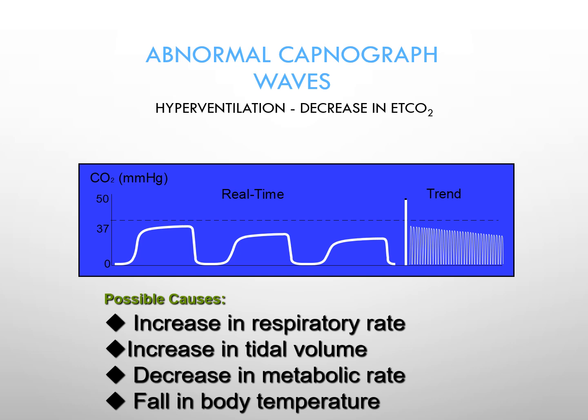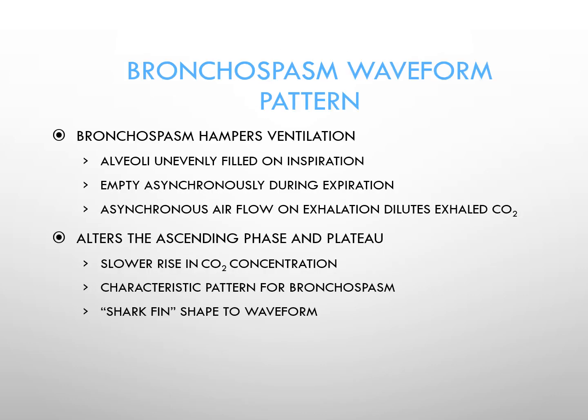A decrease in metabolic rate, where you're cooling a patient very rapidly for targeted temperature therapy. And again, that last one is really related to those last two bullets, a decrease in metabolic rate and a fall in body temperature. They're not the same, but they're certainly related phenomena that need to be considered when you see a waveform like this.